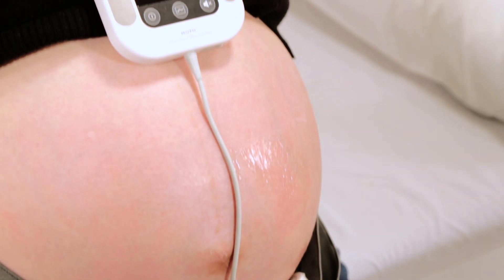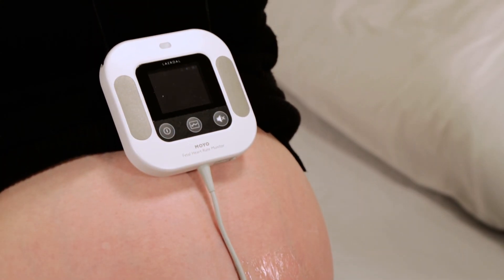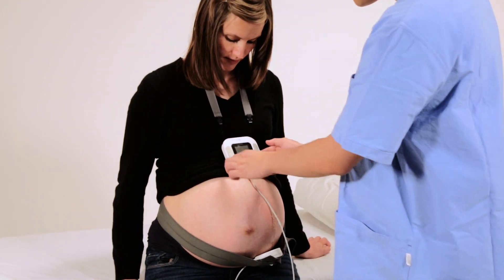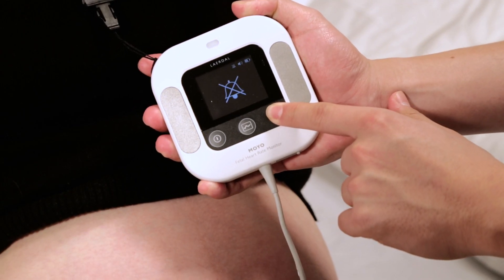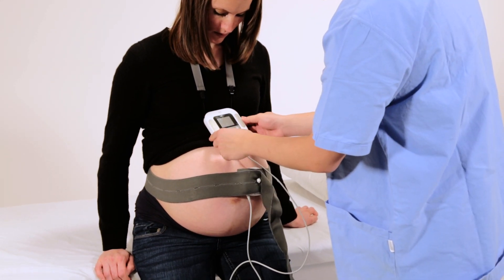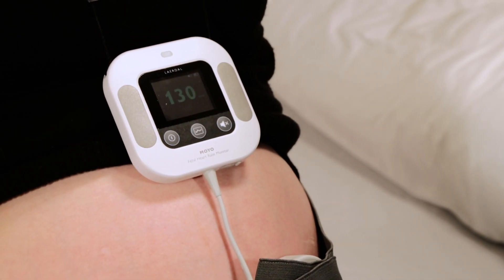If the ultrasound transducer is displaced and fetal heart rate is not detected, Moyo will sound an alarm and display a question mark. The alarm can be silenced and the ultrasound transducer can be repositioned to detect fetal heart rate.